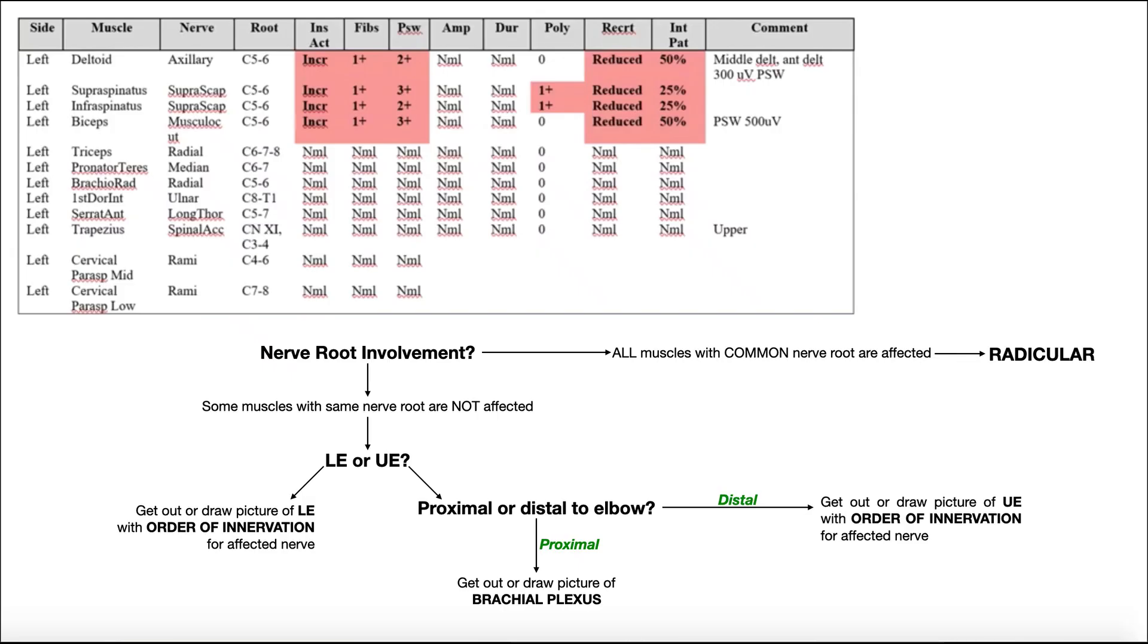In the previous videos, we've been looking at the sample EMG studies, and we've been trying to figure out what type of nerve injury there is. Is it a demyelination injury? Is it axonal injury? So now we're going to switch gears and now figure out where the nerve injury is.